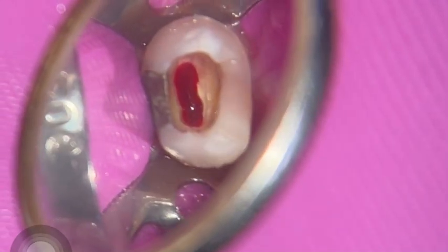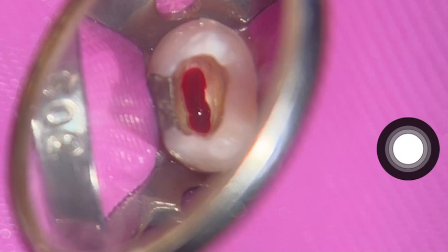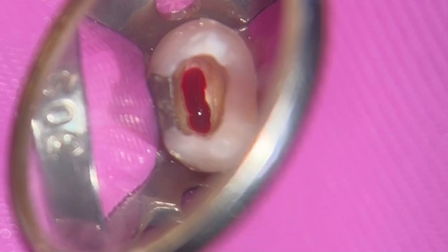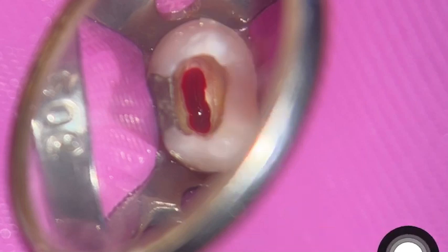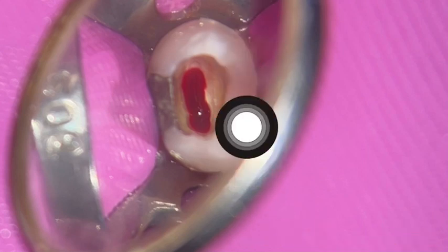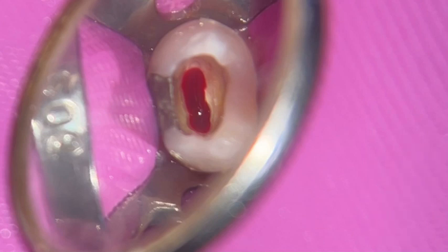When I first accessed that tooth, I've removed all the decay and did my pre-endo buildup. Always spend time on this because a pre-endo buildup will save you a lot of time. You can always work without this wall, but you're always going to be afraid of hypochloride leaking into the patient's mouth and getting a horrible reaction. You don't want that. Just make sure you rebuild this. Although you can put some liquid rubber dam down there, sometimes you get stuck and it's so hard to get out. Save yourself some time — do the pre-endo buildup beforehand.